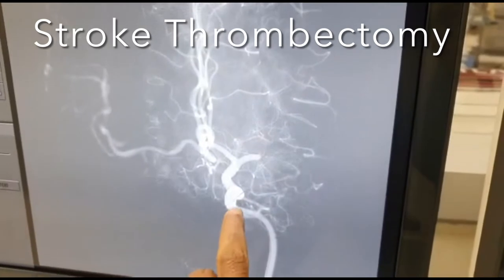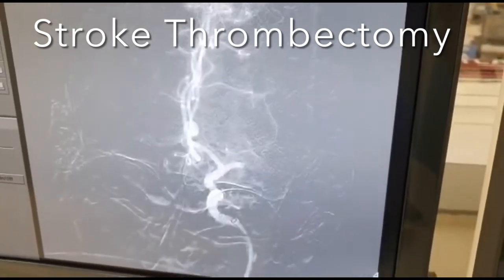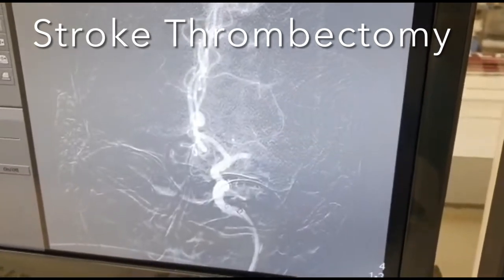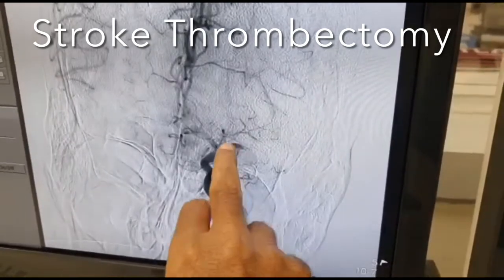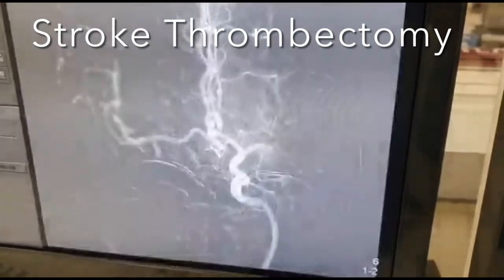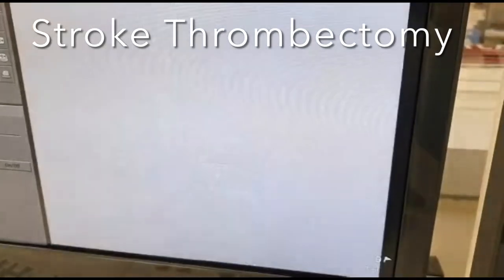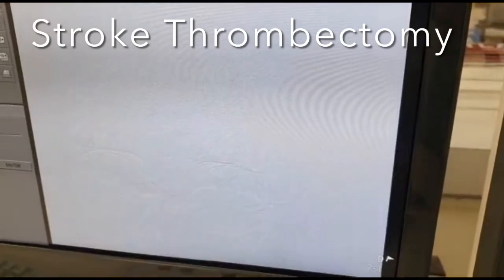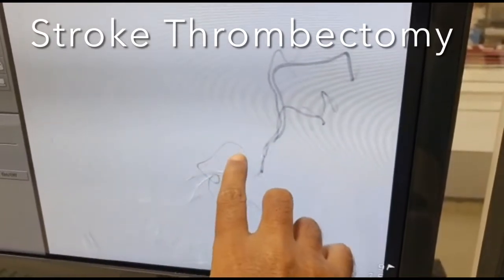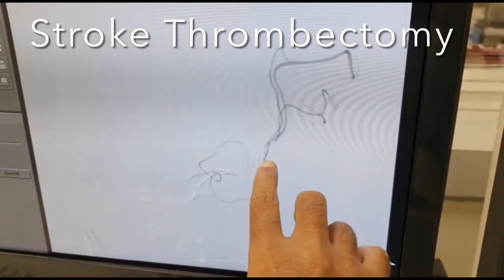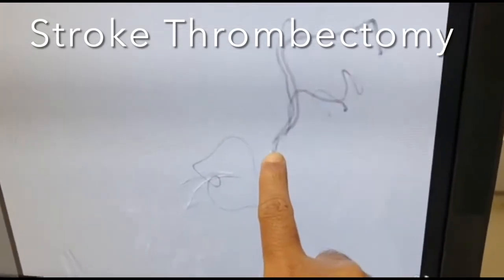The guiding catheter is placed at the petrous carotid. You can see the M1 occlusion. A microcatheter is passed across the occlusion and it is positioned distal to the occlusion.